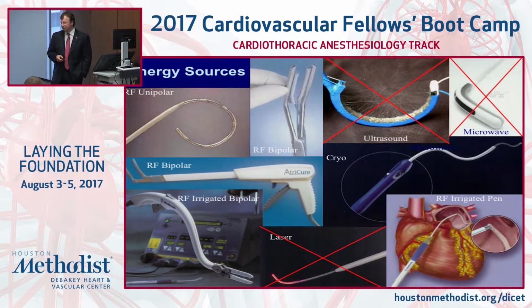Some of the energy sources have come and gone. We've used all of these, and the microwave, the laser, the epicardial ultrasound, all of these devices had a 6-month follow-up rate, freedom from AFib of 80 to 90% in all the studies that were done, and suddenly they were pulled off the market, and people were reporting outcomes of 20%. So it's very important, when you're looking at the literature and trying to figure out the outcomes of these procedures, to look at how the patients were followed up. Because if you have a whole bunch of patients in paroxysmal AFib and you do spot check EKGs in your office at 6 months, you're going to get 80% of them that don't have AFib whether you treated them or not.